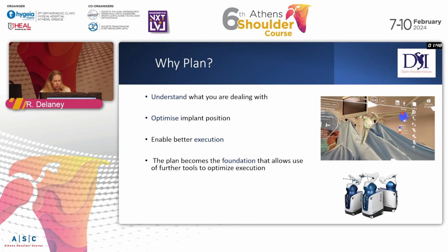So the reasons, again, to plan: understanding what you're dealing with, optimizing the position, which we hope should translate into better longevity of our implants. We don't have evidence of that yet, and I think it's going to take time to be able to show that. It may be that the advantage is only in the more complex cases, but if you reserve the planning technology and any of the add-on execution tools for the really difficult cases, then you don't have a level of comfort or familiarity with them if you haven't gotten good at using them in the straightforward cases, and that's why I like to plan all of my cases.